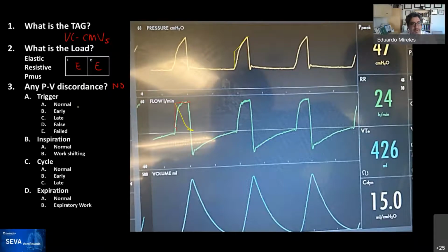That theoretical thought that humans do not breathe that way doesn't carry any background that I know of, and I'm happy to be shown otherwise. I've looked for it. I have not found any. So at least on volume control in a passive patient, it doesn't make any sense. How about that? Let's settle that. You're in agreement with that? Yeah, absolutely. Thank you. All right.